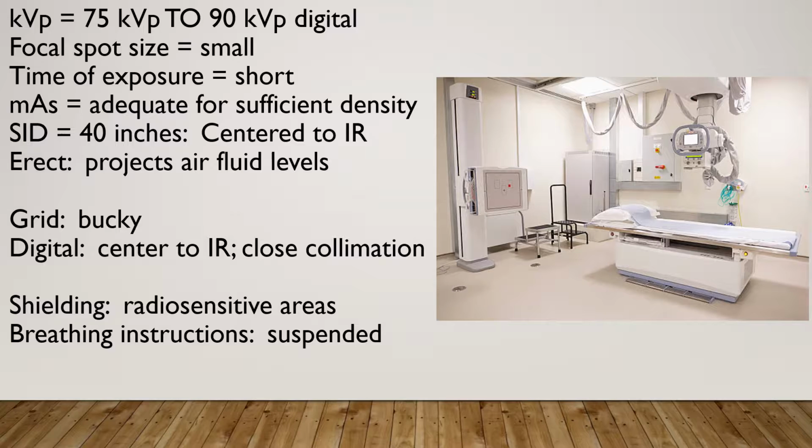The reason we are using a bucky is because we are x-raying something that is bigger than 10 centimeters in size. Remember, a knee is about 10 centimeters, so anytime we x-ray anything bigger than a knee, we are going to have to use a bucky. And that's because we're going to have a grid inside of that bucky. So once we select a grid, we're going to need to make sure that our kVp is over 70 kVp whenever we're using a grid.